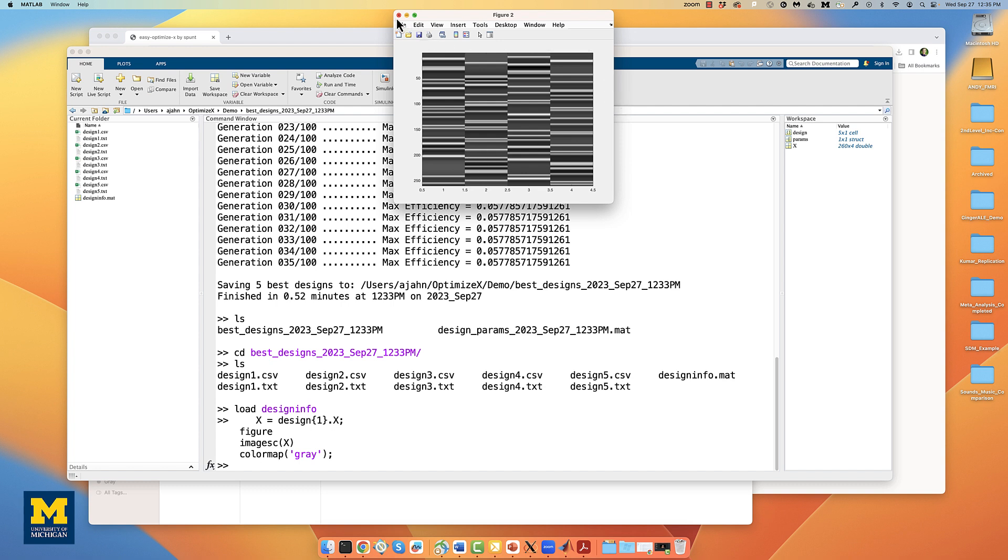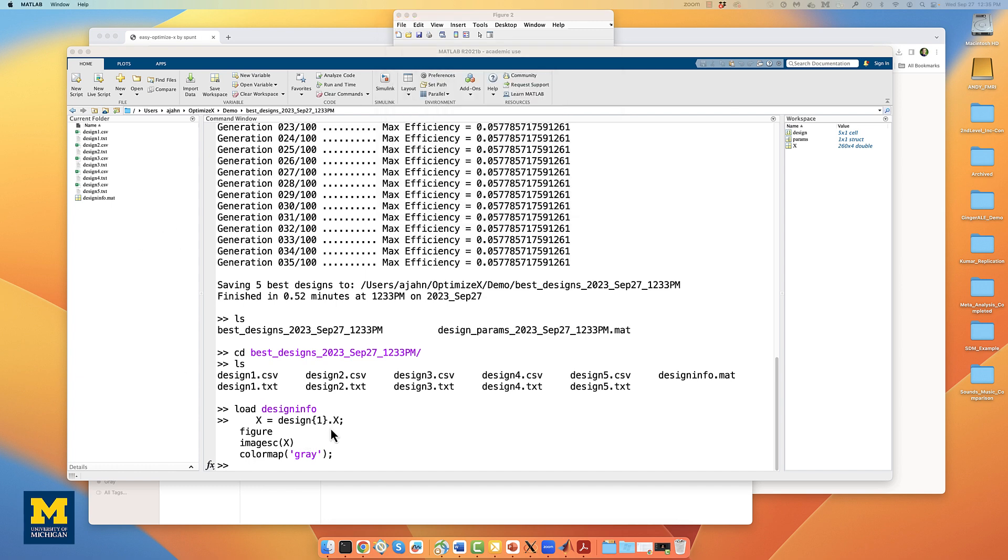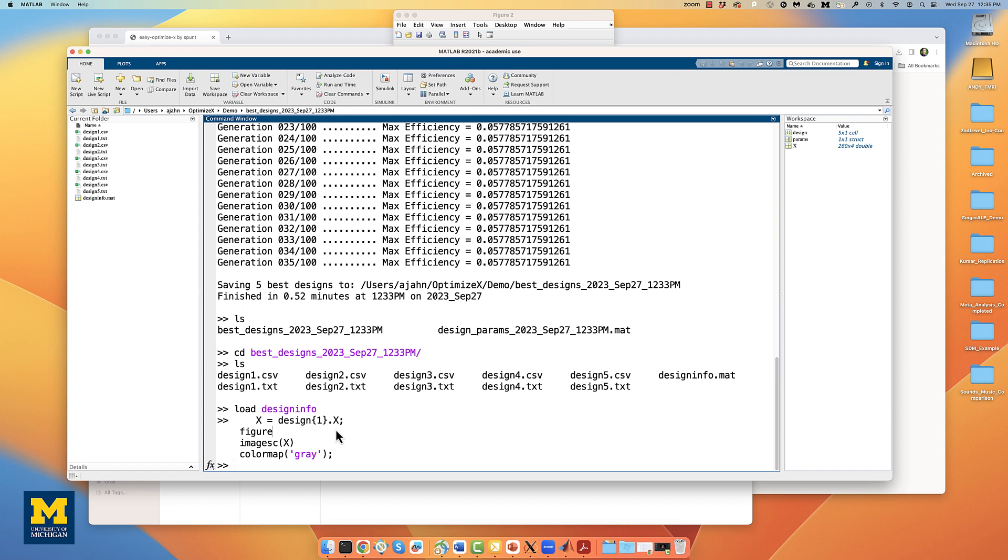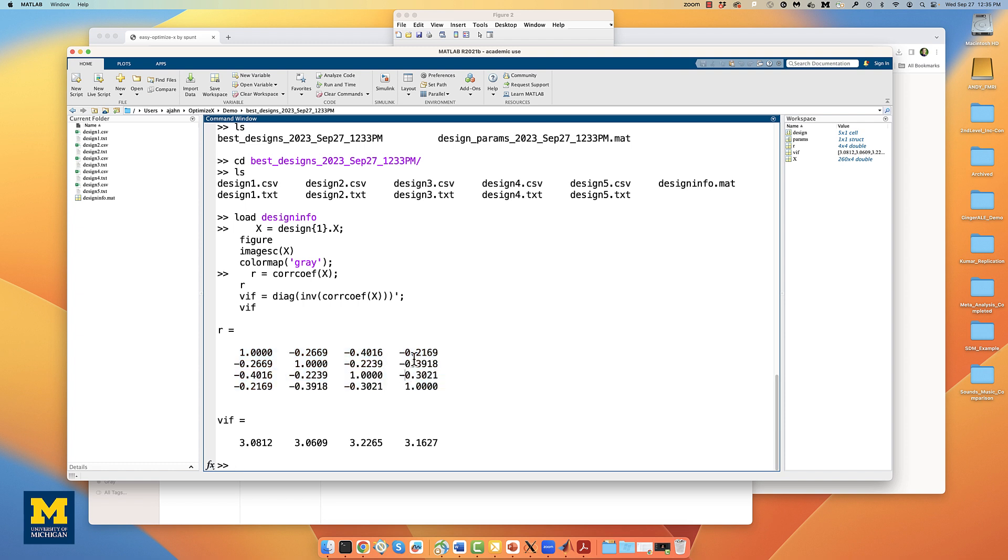With this design matrix, you can also look at the correlation between the regressors and the variance inflation factor by using this following code. R is a correlation coefficient, showing pairwise correlations between each of the regressors. As a general rule of thumb, anything below negative .4 or above positive .4 indicates a moderate correlation and something you might want to look into in more detail.